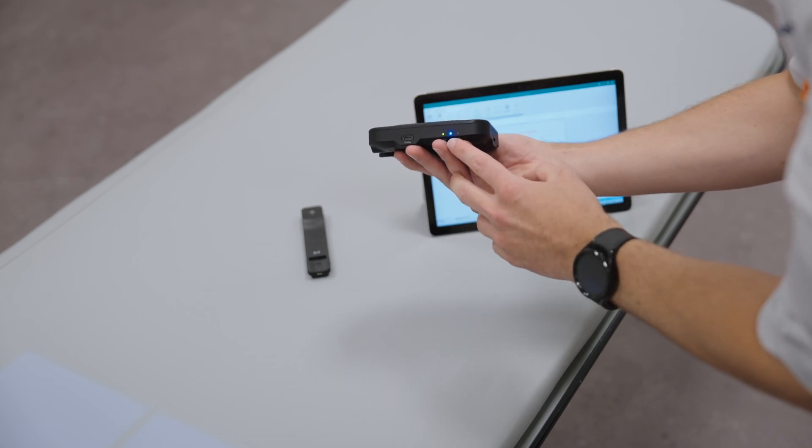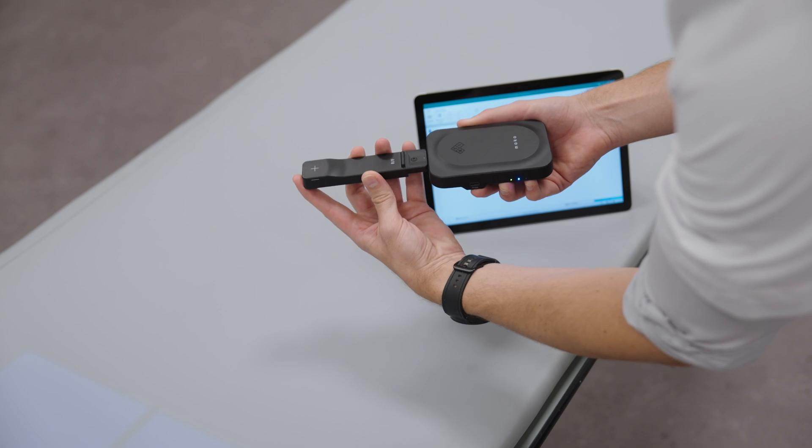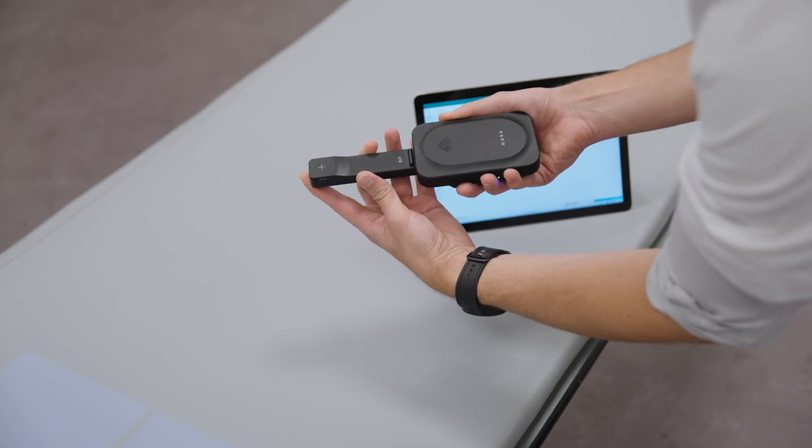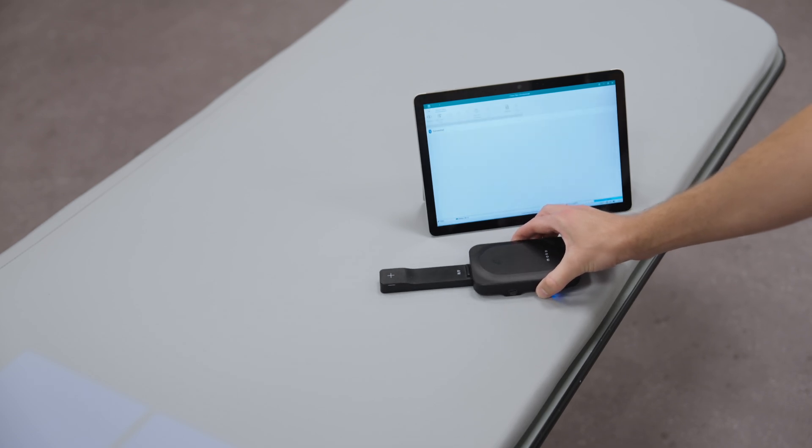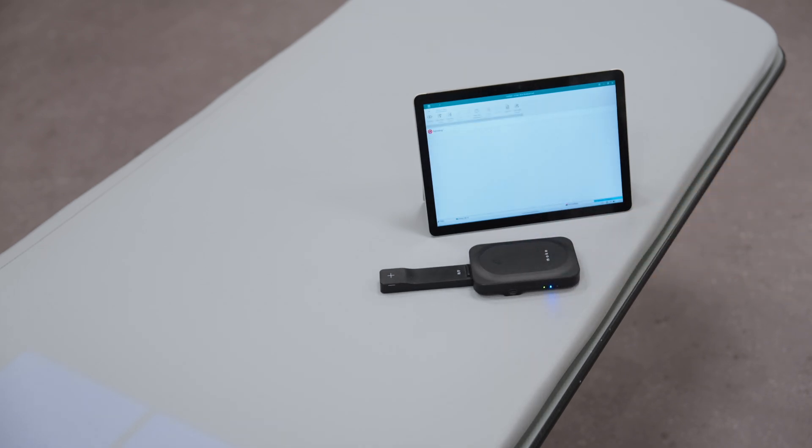Connect the Mako RF probe to the base unit. Mako auto connects to the display device via Bluetooth, shown by the solid blue light, which unlike other sensors allows a fully wireless setup. The intuitive Ocean software displays measurement parameters from Mako. The system is now ready to measure.